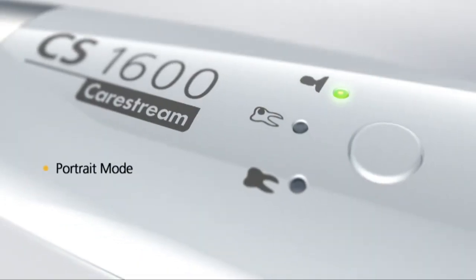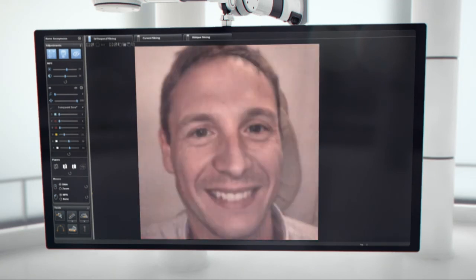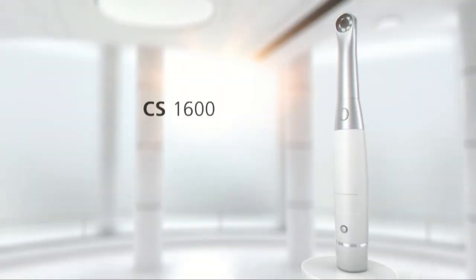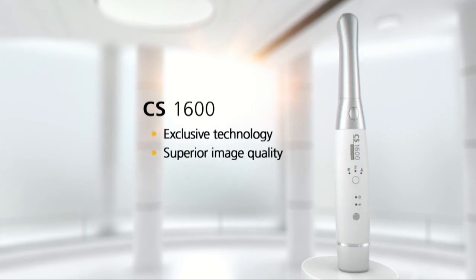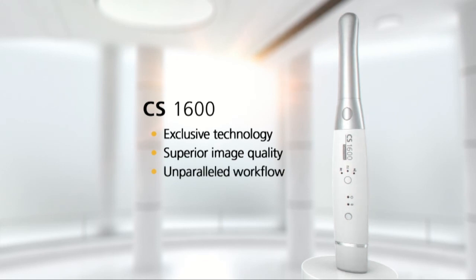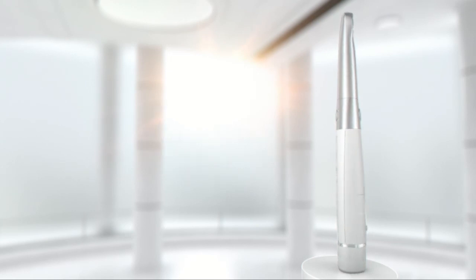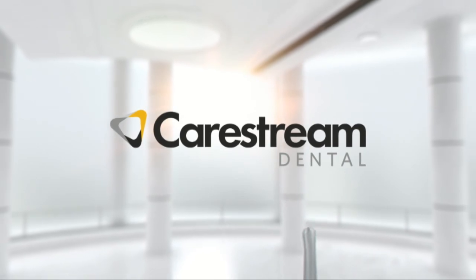Switch to portrait mode for stunning patient portraits each and every time. With exclusive caries identification technology, superior image quality, and unparalleled workflow, the CS1600 provides fast, accurate results. Improve your diagnostic power with the CS1600.